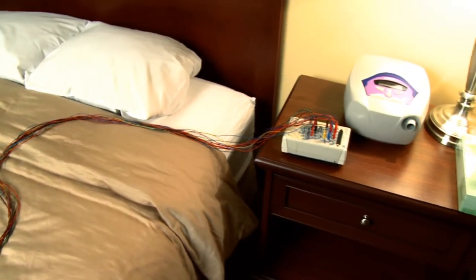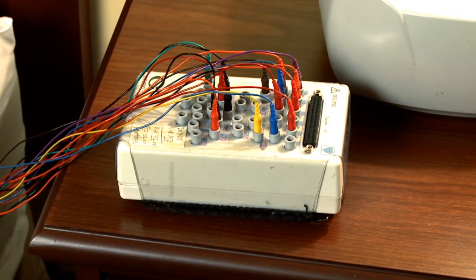As a patient, you're usually asked to come to the sleep lab at about 8:30 in the evening. At that point, the technician will confirm your identity and then wire you up with multiple things. There are lots of points that they put on your head. The EEG is what it is, and people see that on television. There's a microphone that goes near your chin, some additional wires that are attached near the eyes, and usually a headband is associated with it. A band across the chest, and then EKG leads. So there are a lot of wires and a bridle associated with it that get attached to a patient.